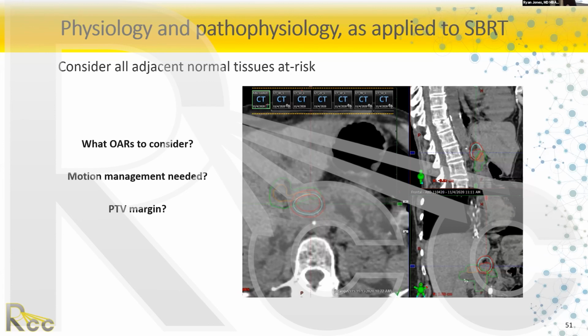This is the commonly accepted way you contour the central hepatobiliary tree. If you look at liver SBRT literature, there have been cases reported of bile duct stenosis and fatal hepatitis resulting. Thankfully, it's a reasonably radio-resistant structure. You contour the portal vein, you expand, and you think you're catching all the bile ducts, the common hepatic duct, the cystic duct, in this expansion. And she had, I can't remember if this is the one.